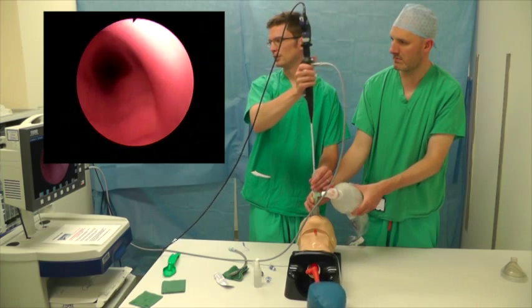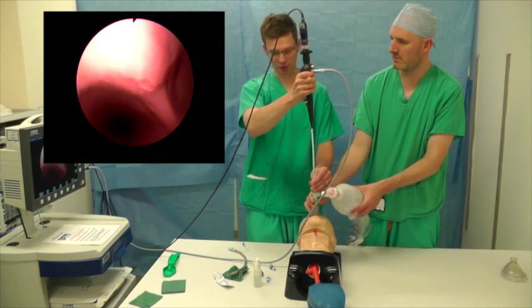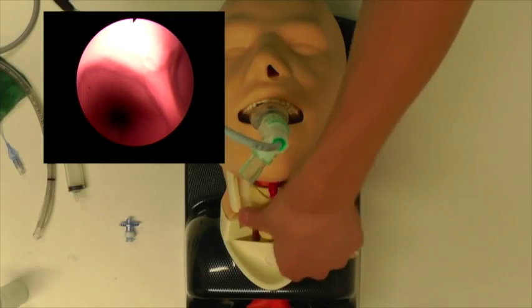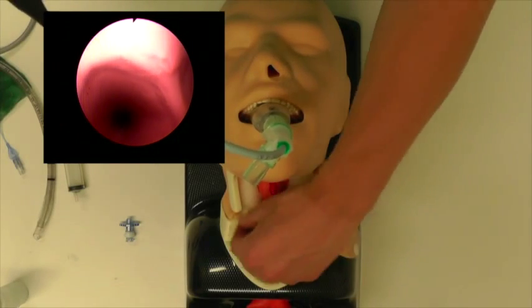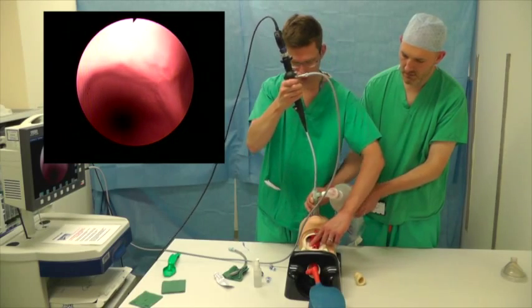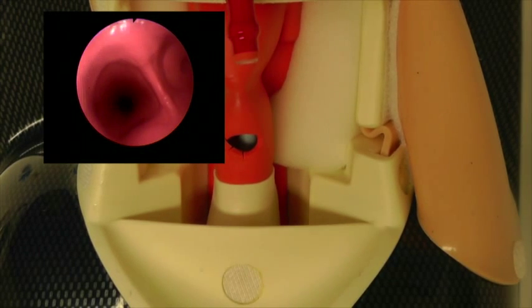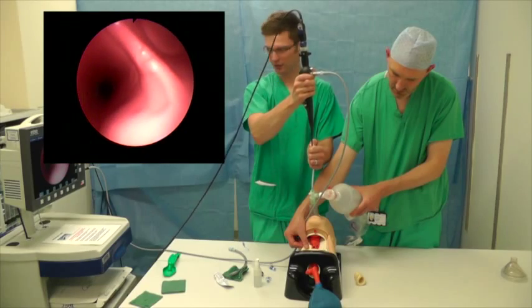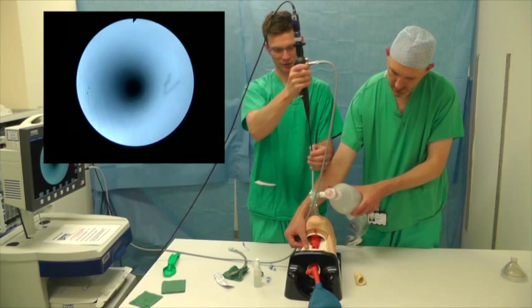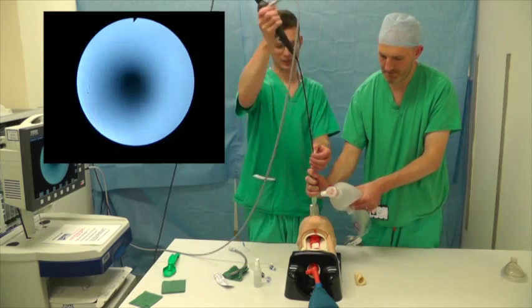Go all the way down as far as the carina. Although the tip of the scope is at the carina, if you open up the front of the mannequin's neck you'll see that the tip of the Aintree catheter is only just at the glottis. So it's really important at this stage to advance the Aintree catheter further in — that's gone a lot further down to where the carina is. Stabilize the Aintree for me and take the camera out.